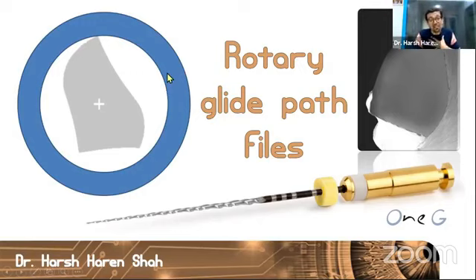Another advantage, and my favorite advantage I can tell you, is when you're working with a file like 1G, any file which has this asymmetric cross section, how this helps is you have a lot of dead space available around the file. You could term this as chip space, you could term this as debris space. So all the debris that is getting collected during preparation can easily auger out of the root canal through the orifice and not through the apex, because there is so much of space available.